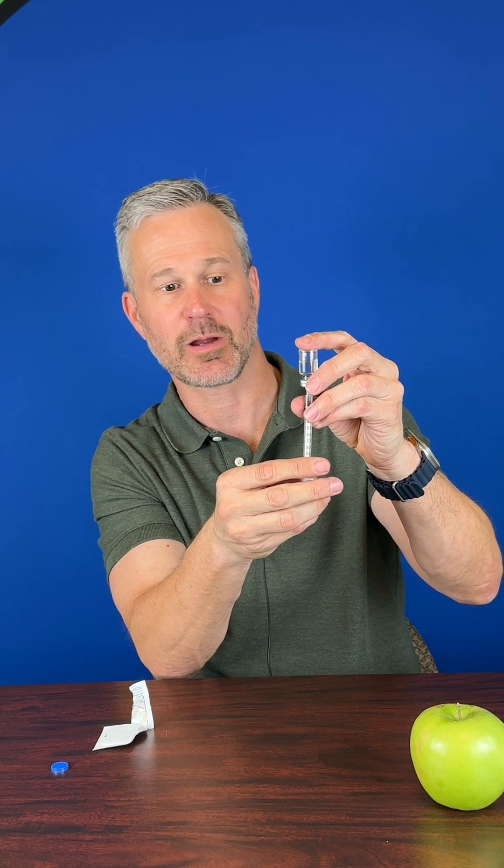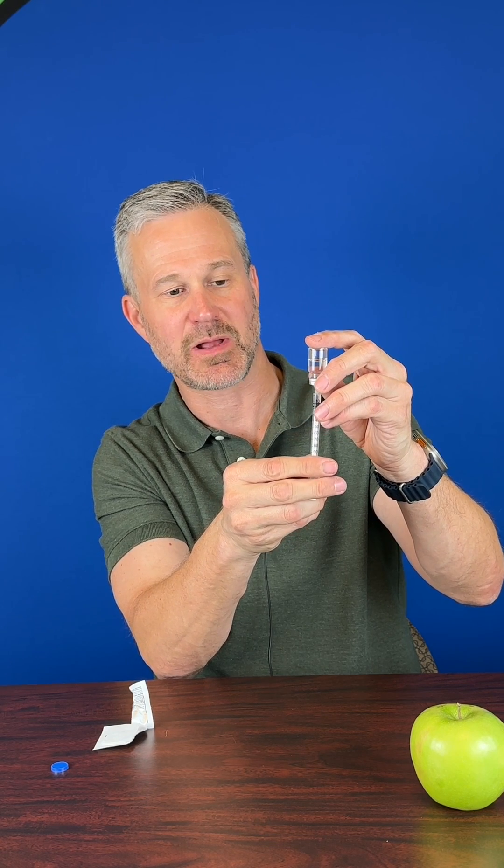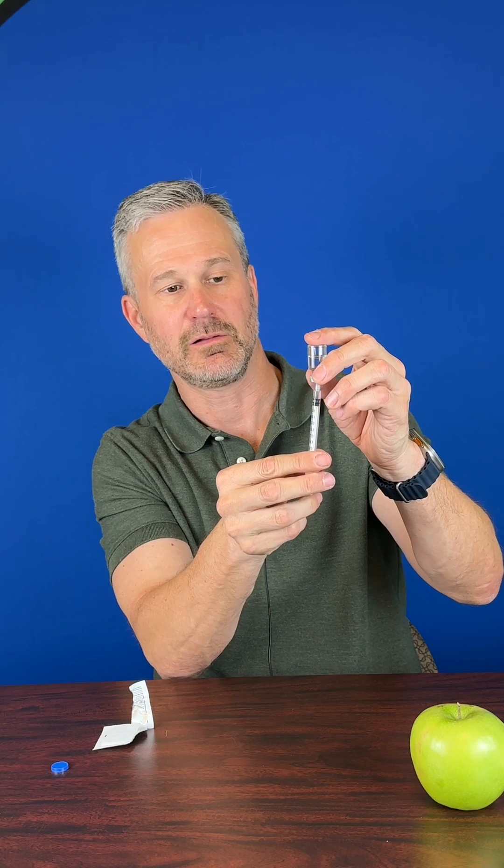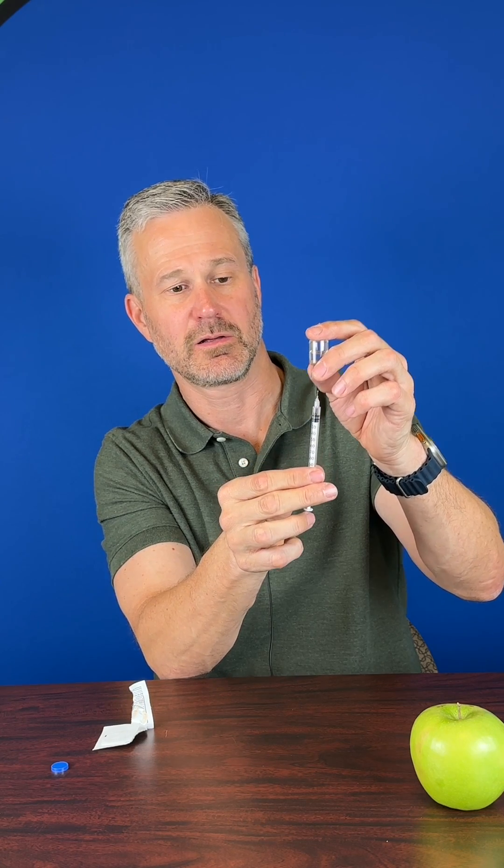Tap it several times to make sure there are no air bubbles. If there's a little extra medicine, place it back into the vial. When you're done with that, pull it off.